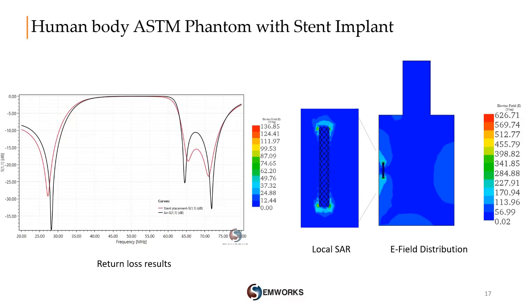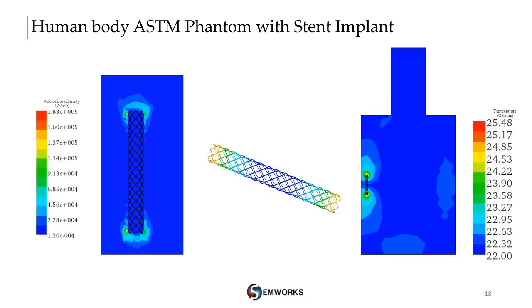As a result, as we can see, the return loss results are not far from the hip implant results, as shown on the left side when compared with the MRI performance in free space. The electric field is also very high around the metallic stent and exceeds 620 volts per meter, and the local SAR distribution achieves 136 watts per kilogram, which is again very high. So from these results we can predict what the temperature distribution will be too.